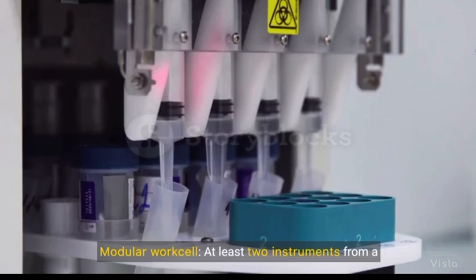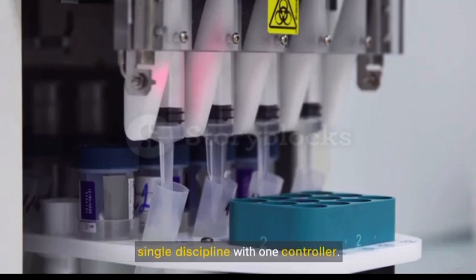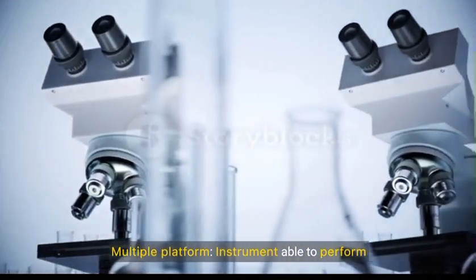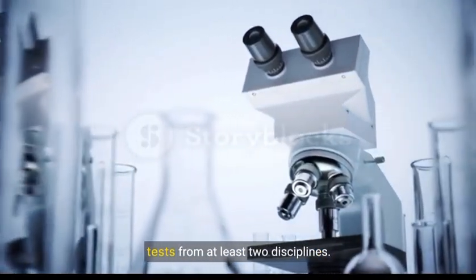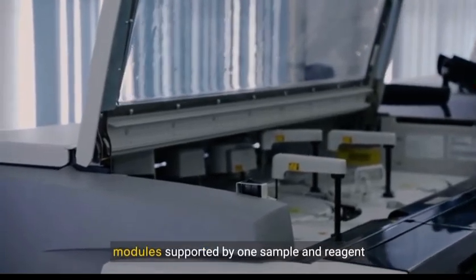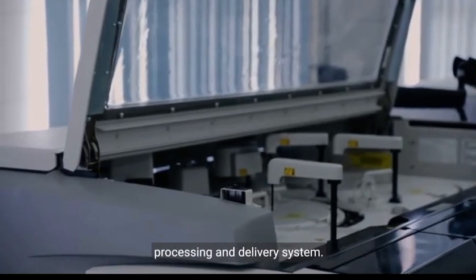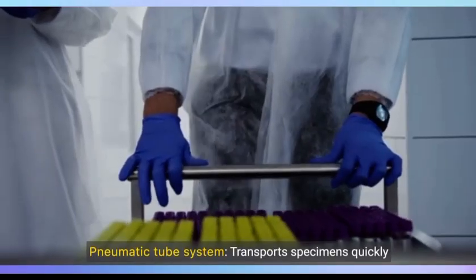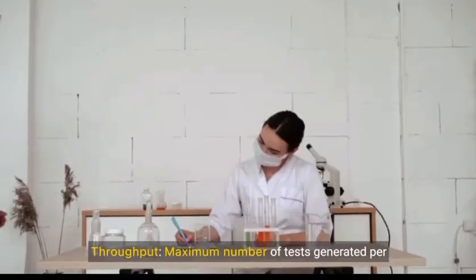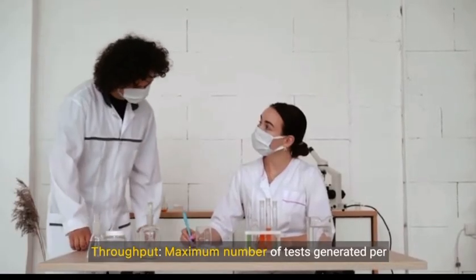Modular work cell, at least 2 instruments from a single discipline with 1 controller. Multiple platform, instrument able to perform tests from at least 2 disciplines. Integrated modular system, at least 2 analytical modules supported by 1 sample and reagent processing and delivery system. Pneumatic tube system, transports specimens quickly from one location to another. Throughput, maximum number of tests generated per hour.